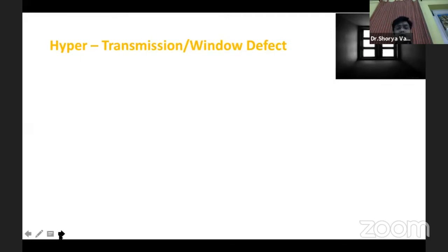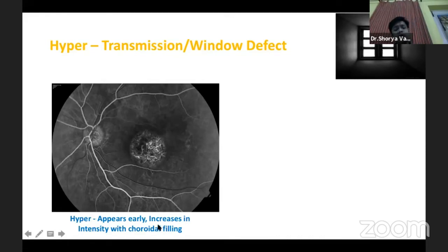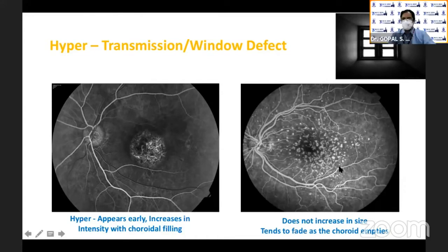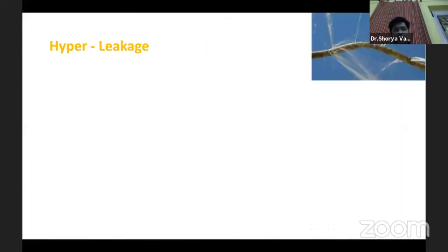The first type of hyperfluorescence is transmission or window defect. As you can see, this is the arterial phase and there is a central area where you can see the choroidal vasculature. This hyper fluorescence appears early in the choroidal and early arterial phase, and intensity increases with choroidal filling. However, it does not increase in size and tends to fade away as the choroid empties. Drusen also fluoresce in this way and tend to fade as the choroid empties.